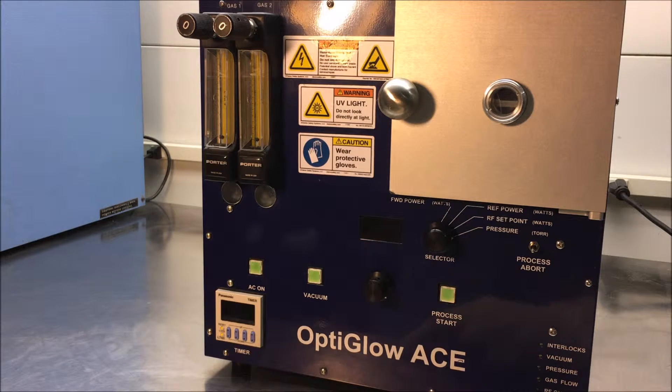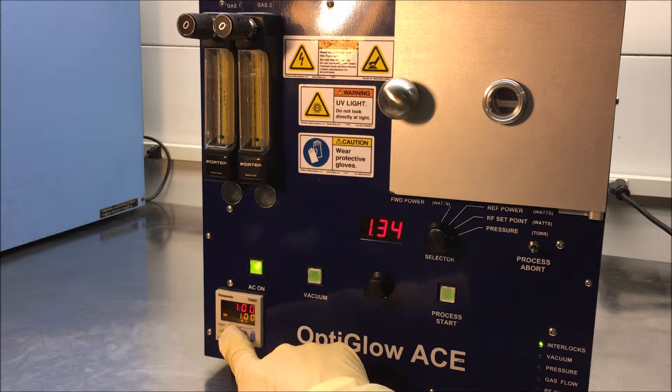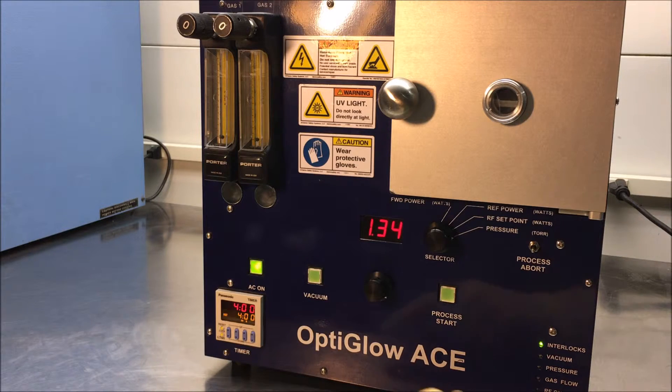Now we're going to start the system. First you press the AC on button. You'll notice that there's a timer down here and you can set the timer in minutes and seconds. After the process is complete, the system will shut off.